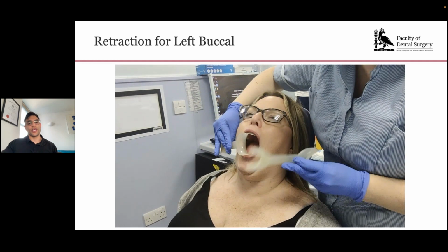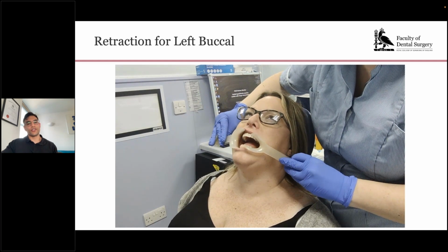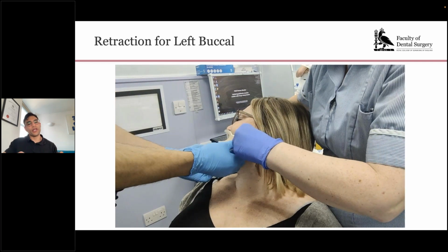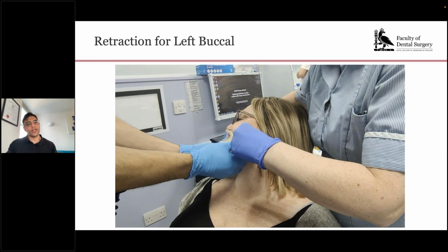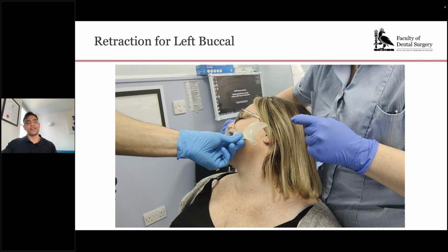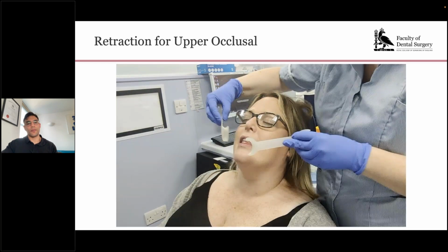So you'll see that once the retractors are placed in, the temptation will be to get the patient to move around by pulling the retractor around. But what you want is to bring it forward like that, so it's not in the photograph and not behind the teeth in the buccal shot.